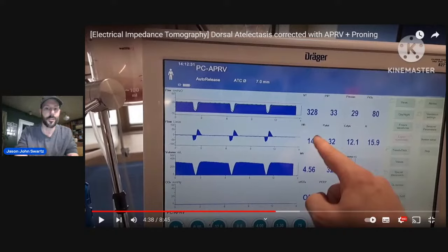stretched at about 3. And when I got there the next day, my colleagues had stretched it to 5, and then I further stretched it to 6. Looking at the previous respiratory rate that was like 30, by the end of my shift it was 14. When I got there back in the morning, the patient was just allowing herself to be ventilated. By the time the morning came, they had stretched it to 5 seconds.